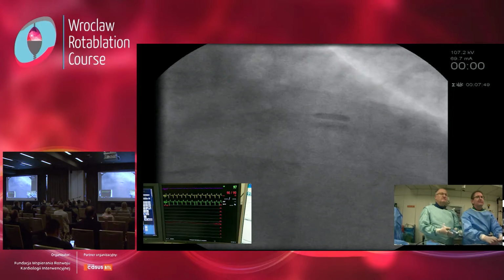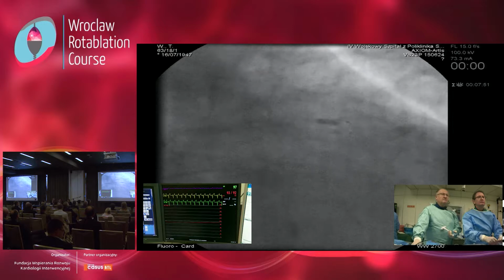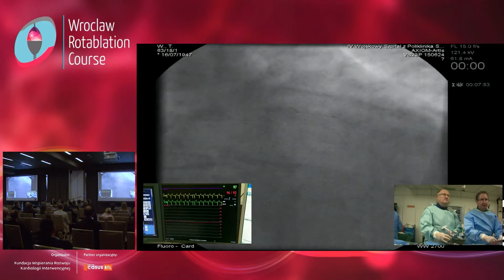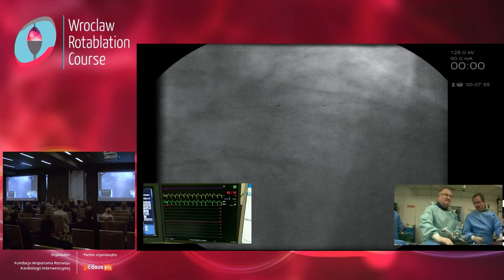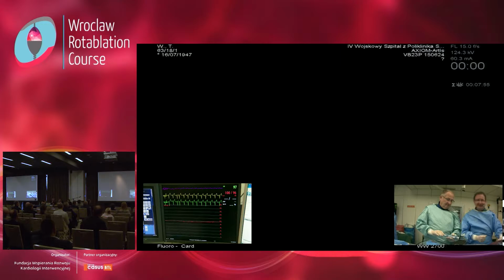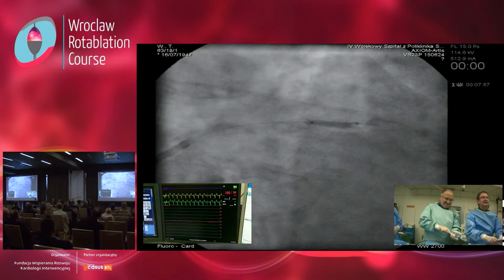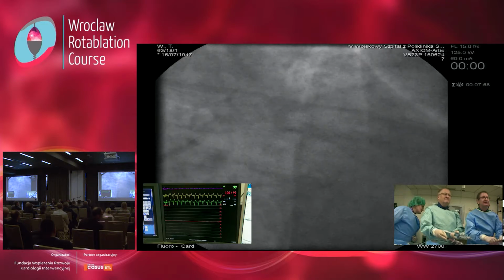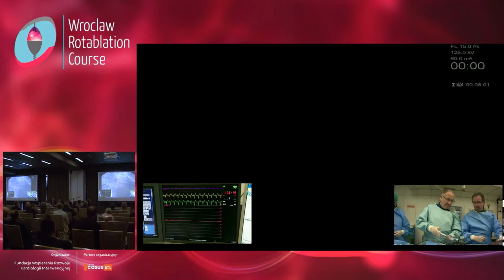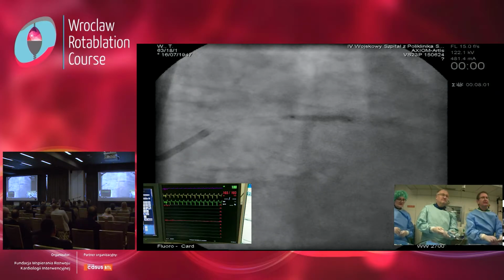In these cases, it's sometimes very, very helpful when you have long balloons on the shelf. Yeah, you're right. Normally we should take now 30 or 40. Okay, but Maciek is fast. Very fast. He is a top guy. Okay, now we go with 20. Yeah, it's not bad.